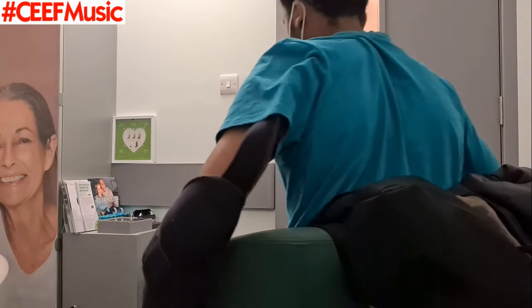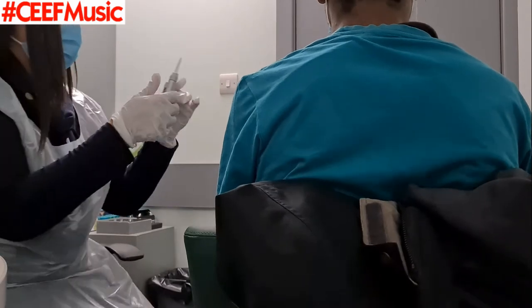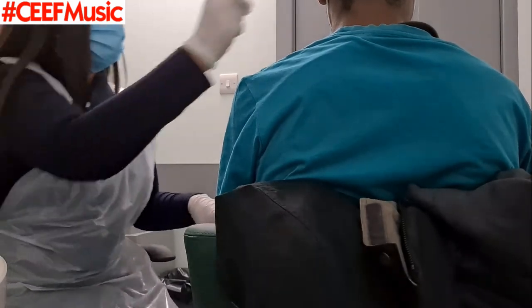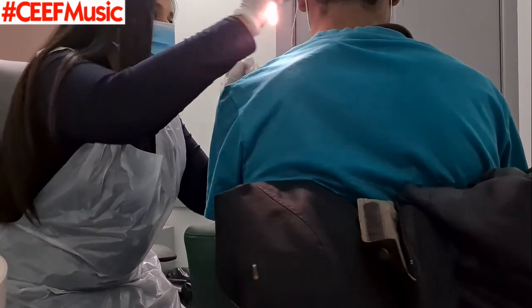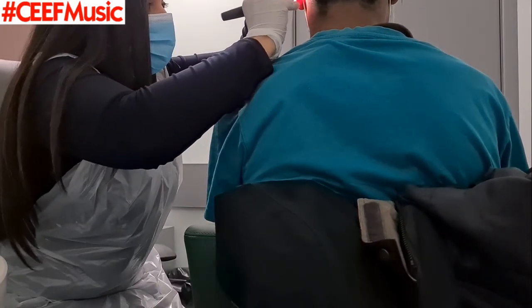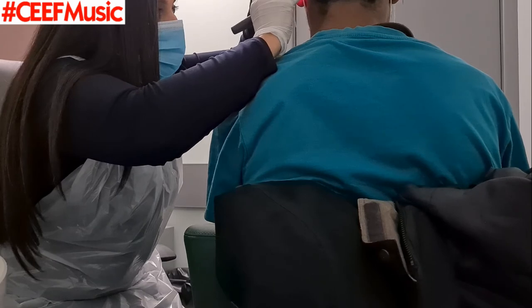You and your bad arm healing up, still turning — all good. So yes, time to do the next ear. That same material I was telling you about, they stick that in — and guys, apologies for the camera angle. I didn't really have much to work with and everything was quite short notice in terms of filming. Either way, you can see them checking, making sure everything's all good.